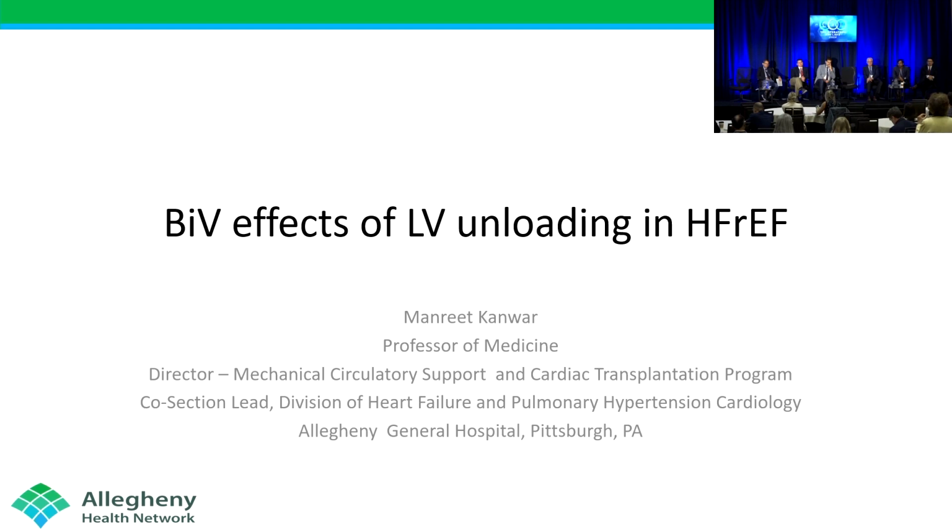I think everybody knows this paper by Uriel. When you increase the speed of the LVAD, you bring down the end-diastolic volume of the left ventricle. At the same time, there is an increase in end-diastolic volume of the right ventricle. So perhaps by dealing with temporary devices like Impella 5 or 5.5, we can avoid this unnecessary disfiguring of the right ventricle and help preserve its function. This is just a hypothesis born from the presentation of these two cases.